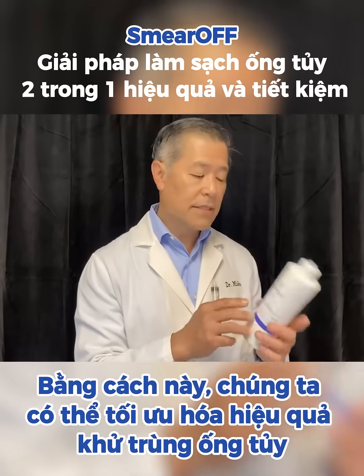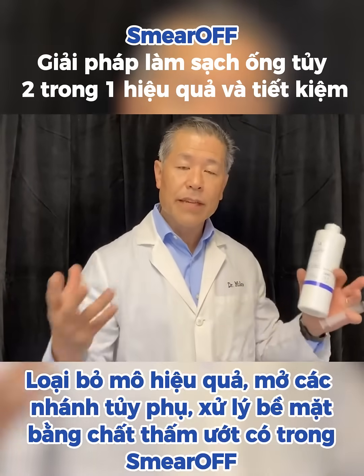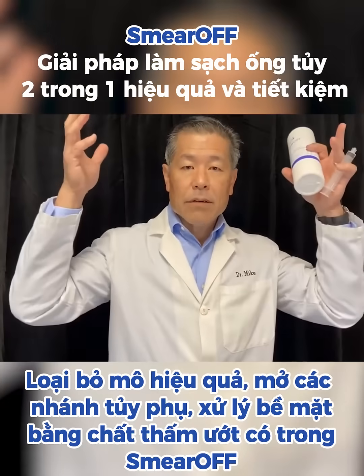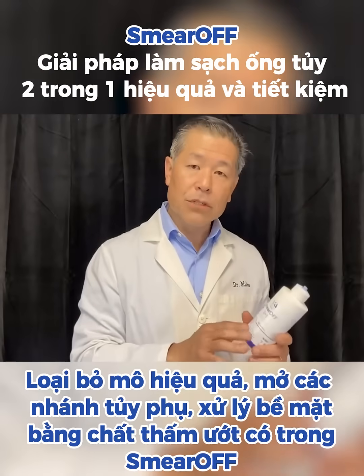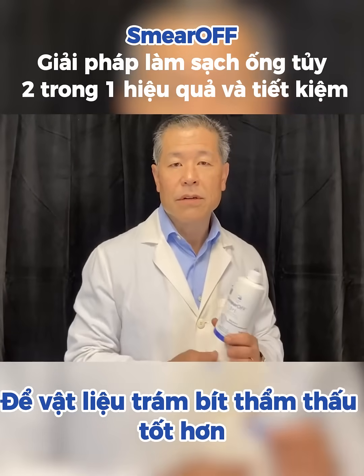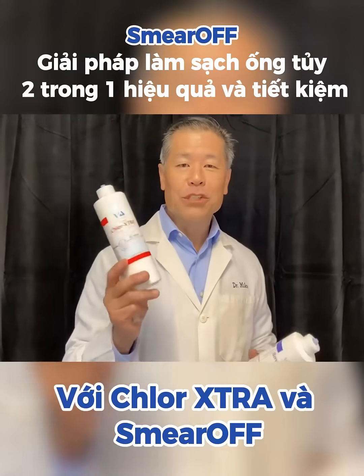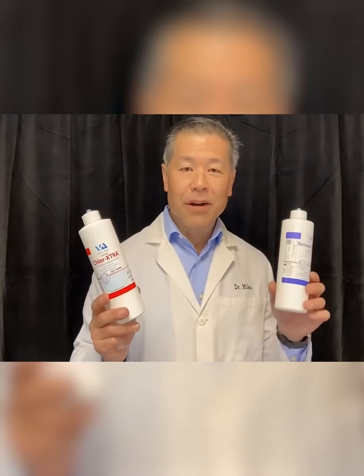By doing this, we're going to be able to optimize the effectiveness of our disinfection of the canals, getting rid of that tissue, open up the lateral canals, treating the surface with special surfactants in the smear off, so we get better penetration of our sealer. We are able to take our four steps down to two — just the chlorhexidine and the smear off.